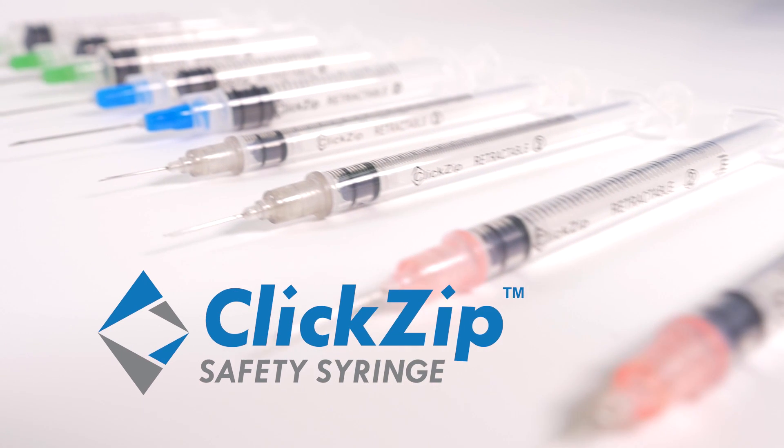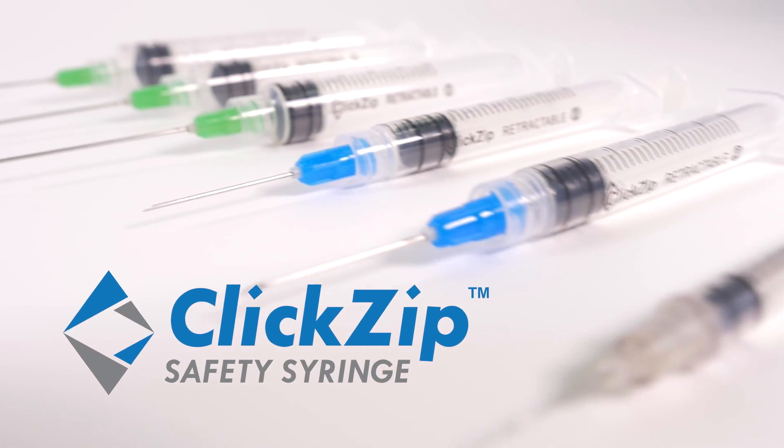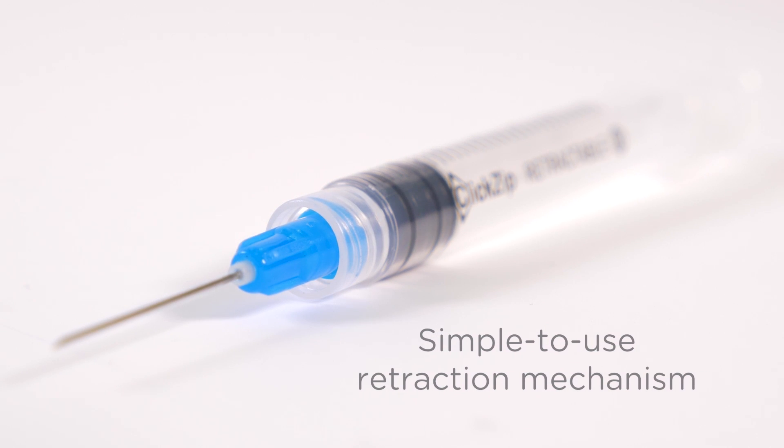The ClickZip Needle Retractable Safety Syringe is a high quality, globally patented Swiss technology needle with a simple to use retraction mechanism to prevent needle reuse and needle stick injury worldwide.